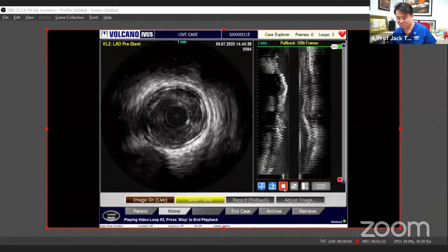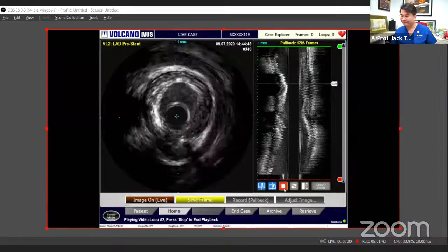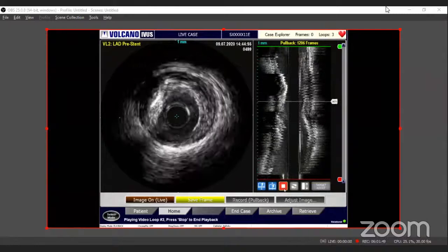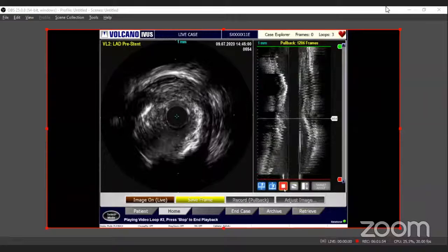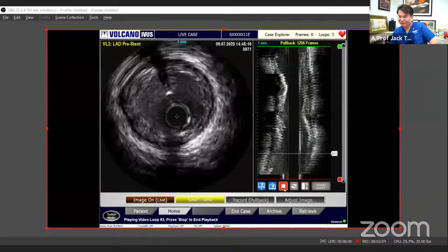Hello? Yeah, Hui Wen. If you look at this case as a fellow in training, what is your main concern and what are the questions in your mind? It's obviously a two-stent strategy. So the first concern I would have is, can I see the angio image? I think it's quite tight. A bit tough. So okay, what is your one concern? Then we can move on to the rest. Just tell me your one concern.